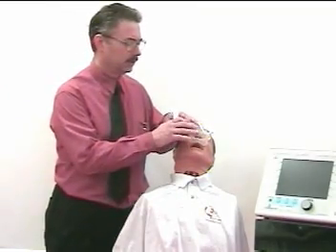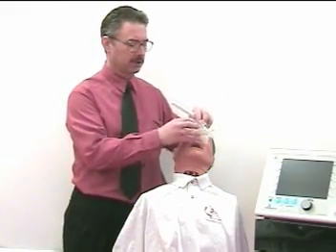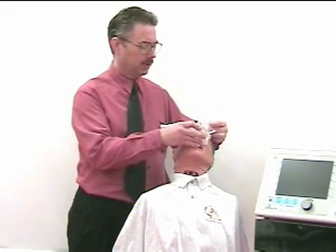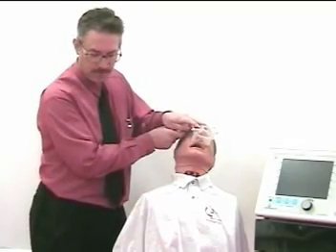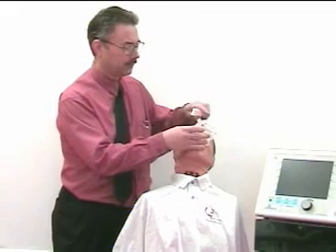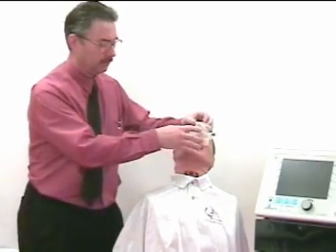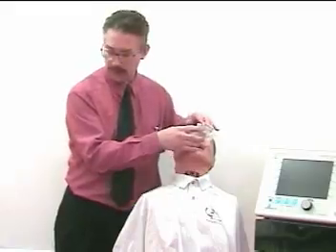assess the size of spacer that you need, because a spacer helps prevent the mask, as you tighten it up, from bending and pulling, causing leaks. So we want to place a spacer. And in this case, we want a number 6 spacer. So we place the spacer correctly onto the mask, and it will sit on the patient's forehead.